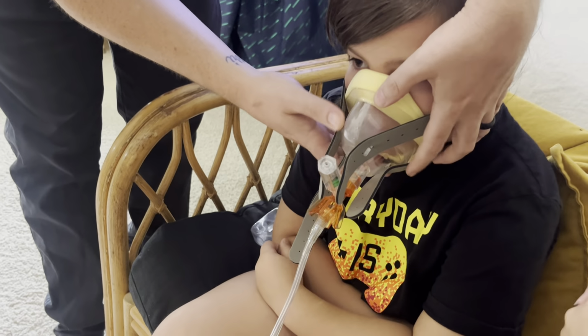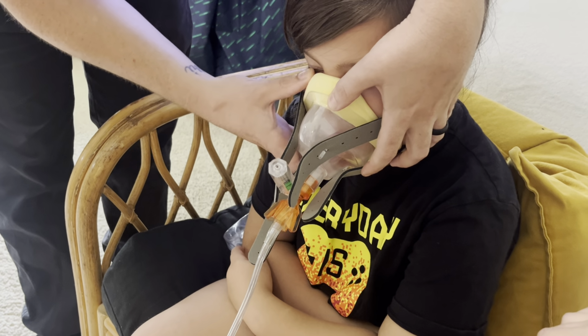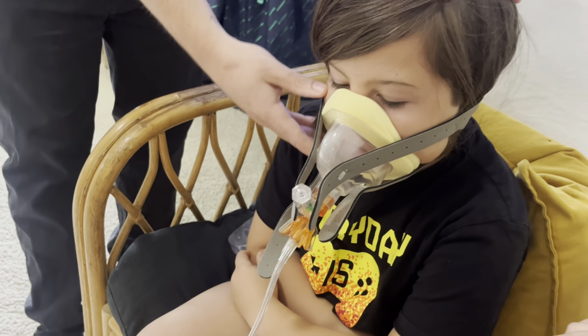Now we let go and we would check for more seals. Breathe real good, bud. Breathe out. Okay, we're not feeling any leaks in the seals, right?